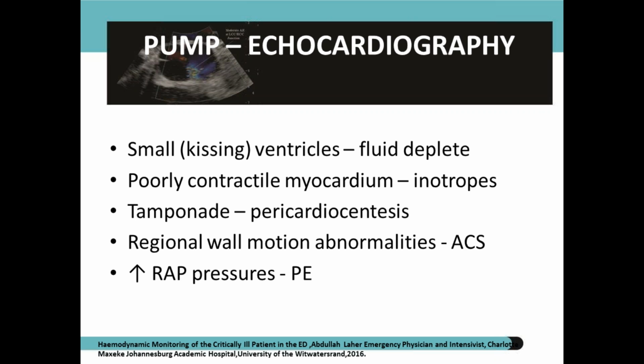So pulmonary embolism is very, very common, which leads to right ventricular dysfunction, which may appear, as Vivek told you, in the form of a pulmonary hemorrhage from the patient's ET tube if the patient is intubated, or from the mouth. So RV dysfunction happening during ECMO is very common, and all that you need to see is the status of the RA. Most of your ECMO cannulas in a V-ECMO lie in the RA. So you see the status of the RA, and you see whether the pressures of RA are rising or falling, and you rule out a pulmonary embolism.